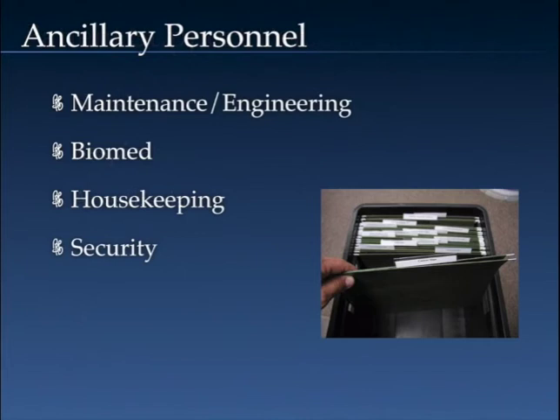You also need to screen and document the screening of non-patient support personnel, for example, maintenance, engineering, biomed, housekeeping, security. Again, anybody coming into the MRI environment, regardless of their job duties, needs to be screened, and it needs to be documented.